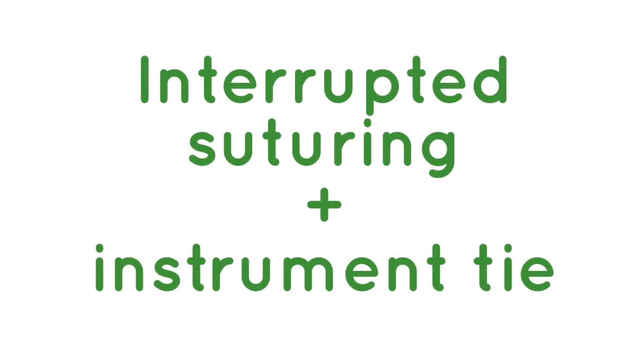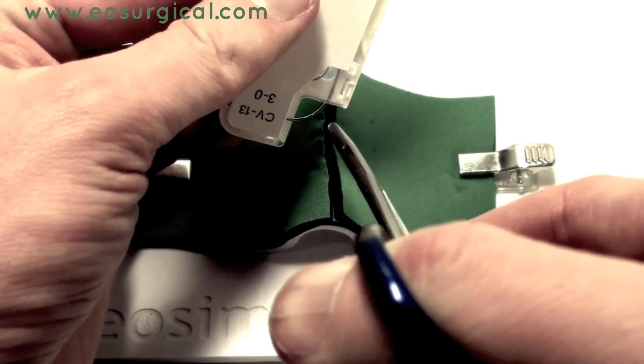Being able to perform an interrupted suture is one of the key skills in surgery. I'm going to show you here how to do interrupted sutures with instrument ties.